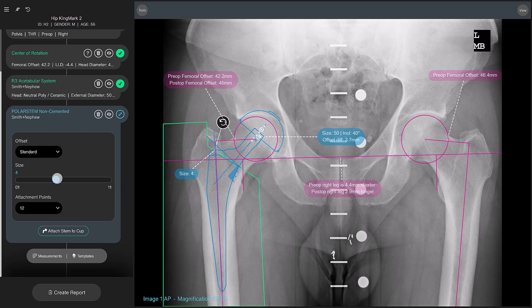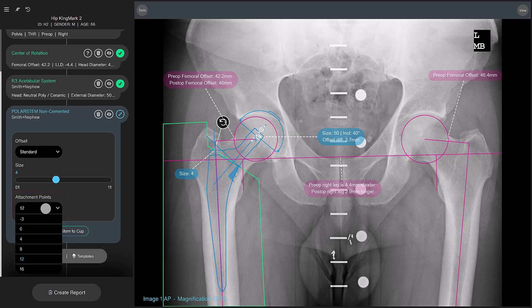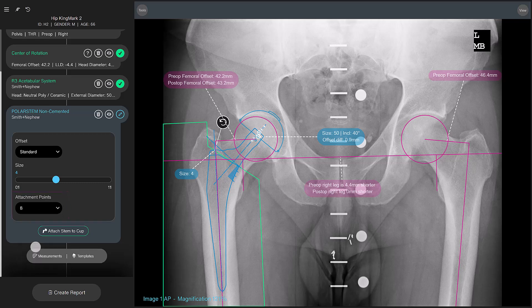So let's choose a different number of attachment points from the template card on the left, for example 8. As you can see, the postoperative leg length discrepancy is now level at 0, which is the desired outcome. To visualize the postoperative result on the image, select Attach stem to cup from the card.